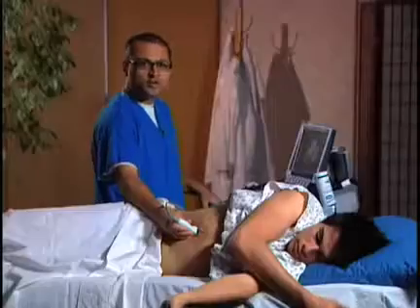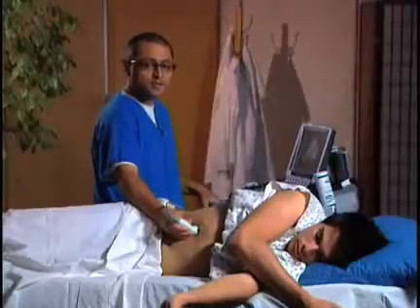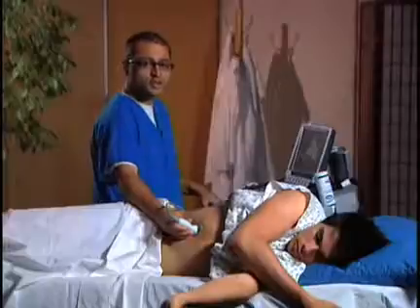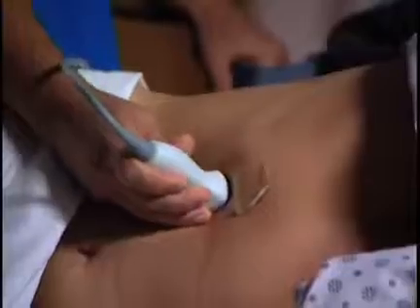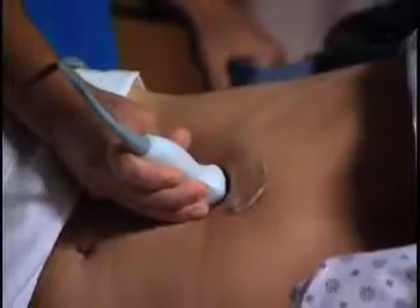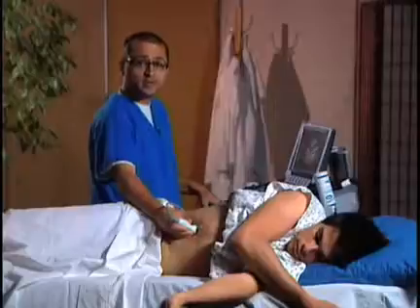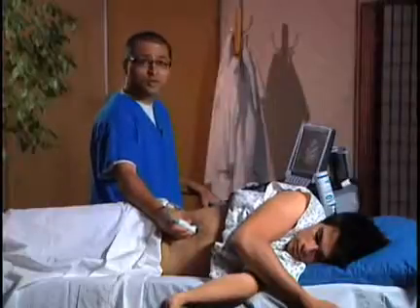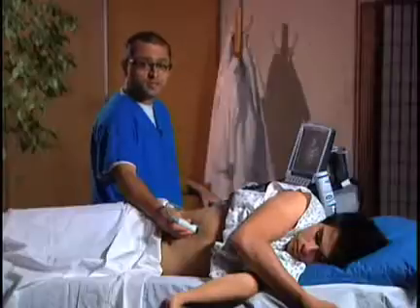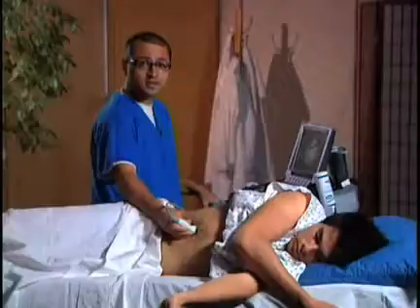So once you've identified the gallbladder and you're happy that you can see the gallbladder in a nice long view, you have to carefully look for signs of a gallstone. Once you see the gallstone, you're going to then press gently into the right upper quadrant and see if they have signs of a sonographic Murphy. Now, we're all familiar as physicians with what a Murphy sign is, and that's palpation of the right upper quadrant and looking for gallbladder tenderness. A sonographic Murphy is much more specific, so we're going to press on the transducer gently and see if that elicits pain.